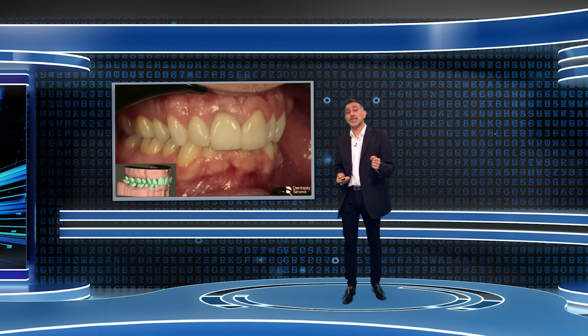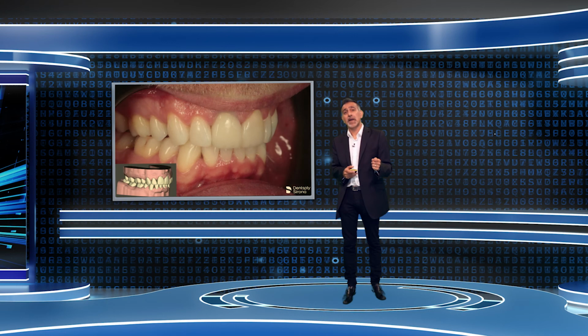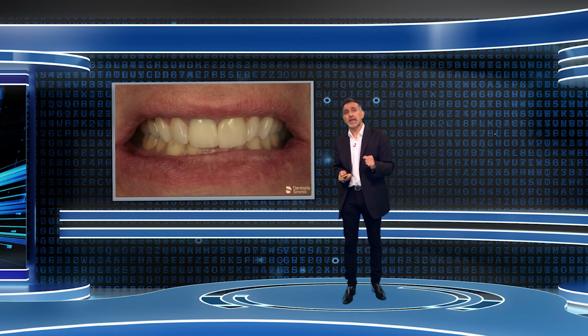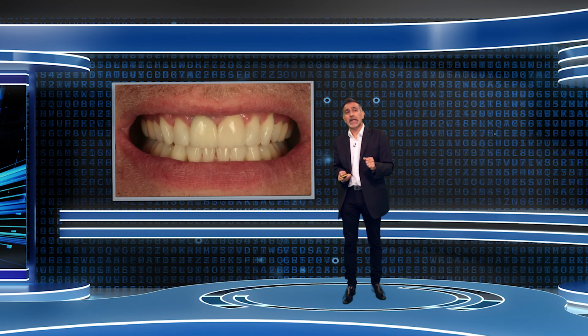And here's a side view predicted outcome, and now we're going to see our final outcome with this patient, undeepening his bite. Obviously I haven't changed those veneers, just a little bit of minor bonding on the laterals and on the lower incisors, and that's pretty much it with that particular case. So here's our start point with a deepening bite, and we undeepened the bite and did anterior alignment on this case. And again, a perfect SureSmile case, start to finish as well.